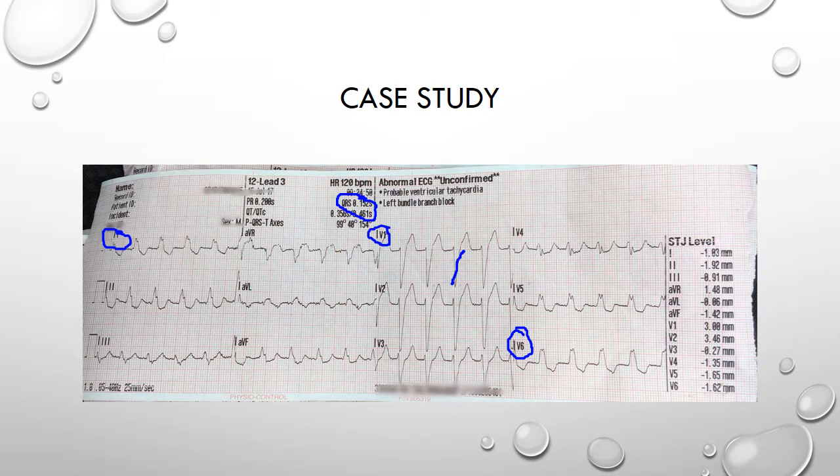There are also widespread discordant secondary STT wave changes throughout the ECG. Now, as already mentioned, this patient was known to have left bundle branch block as his baseline, so where the crew work in London this currently falls outside of local guidelines for cath lab activation. This did not stop them from trying, but unfortunately they were unsuccessful in getting the patient accepted for PCI and had to convey to the local ED instead.